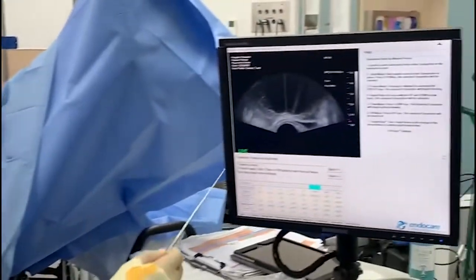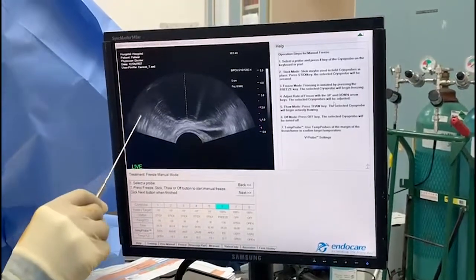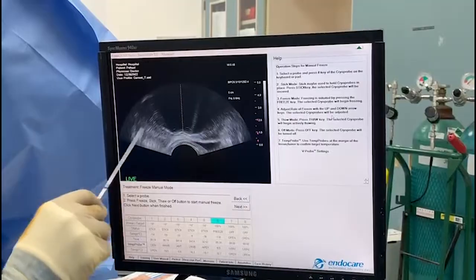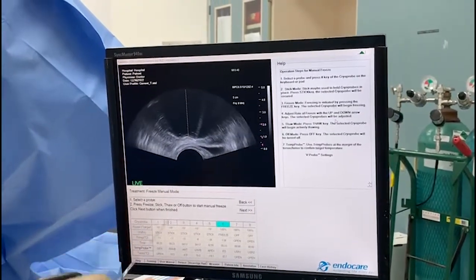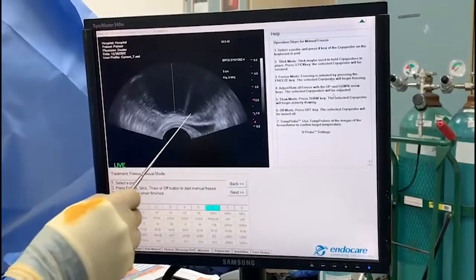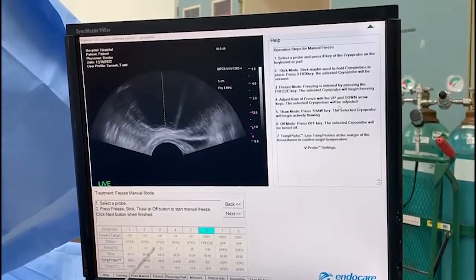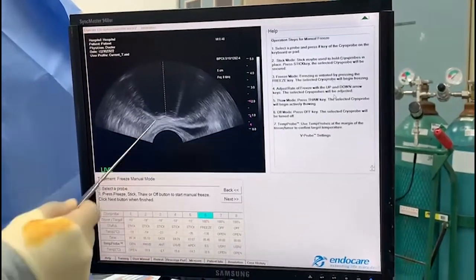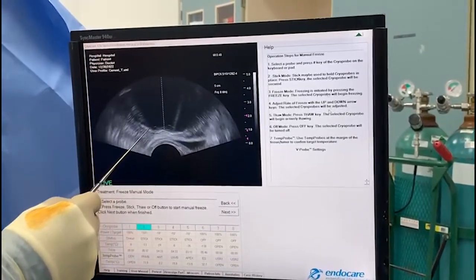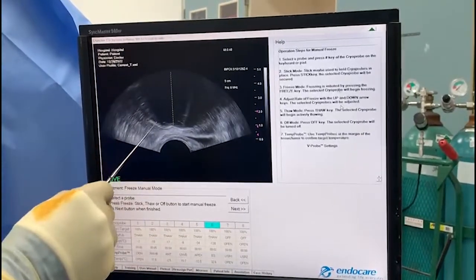One limitation is that the machine has a program chip: if I designate the Denonvilliers probe and it gets down to a certain degree, it will shut off the machine. To compensate, I use the anterior probe as my Denonvilliers. I want to get down to around zero — we're at negative 1.9 right now. We're going to go to full thaw now. I've got this cleavage area to flatten out so we have the entire prostate frozen.